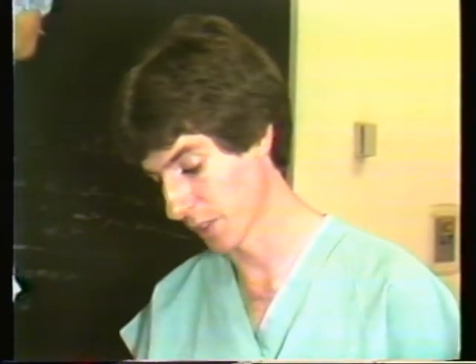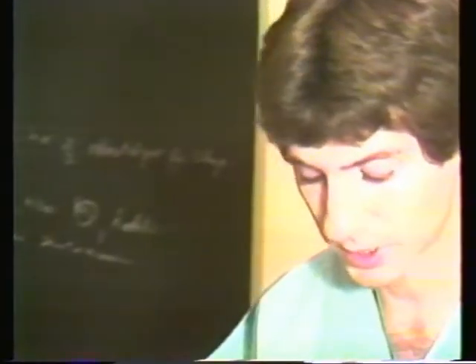Well, what can I do for you, Riley? Doctor, this is a patient who's here to have tooth number 14 removed. She says it hurts her a lot. She's now under the care of a physician who has her on aminophylline and some orange pills that I've never seen before. Physically, she seems okay. Here's an x-ray of the tooth.